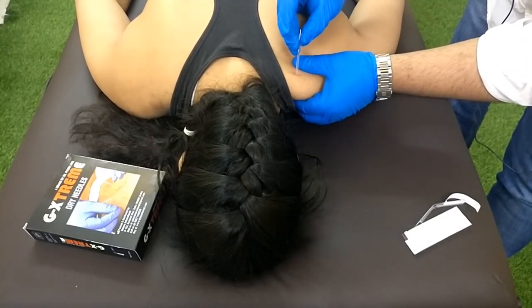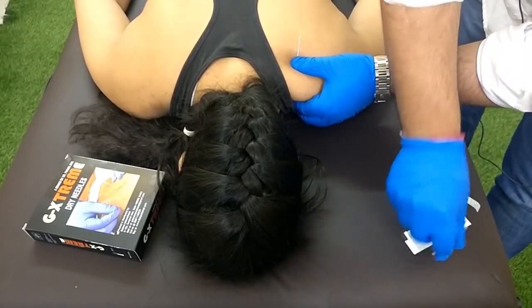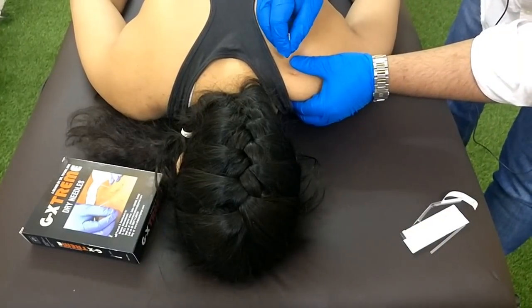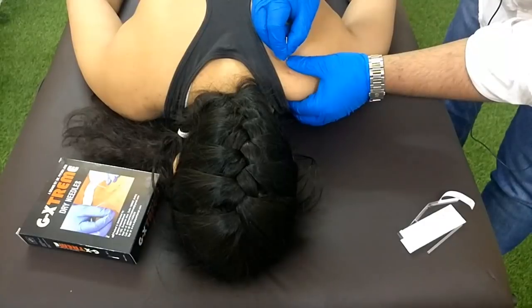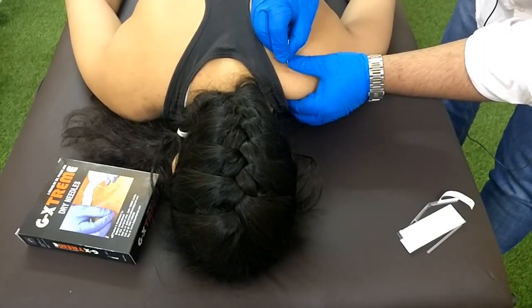Hold the muscle with a pincer grasp. Tap the needle in. Insert the needle inside the muscle. Keep the angle of the needle away from the body. We got one twitch.